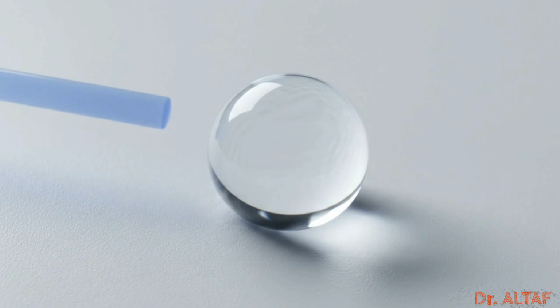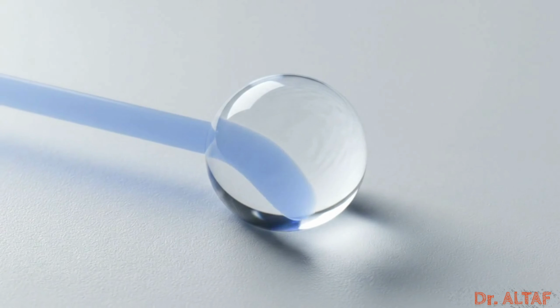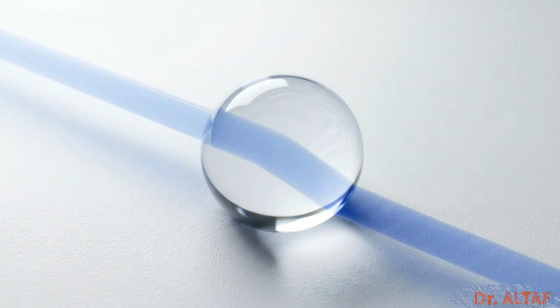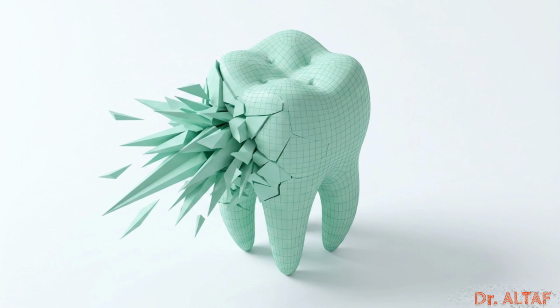Observe this magnified droplet. Intraoral scanners require an exceptionally dry field. Optical sensors are often far more sensitive to moisture than standard impression materials. When light hits saliva or blood, it physically bends. This refraction alters the angle at which the light returns to the scanner lens. That scattered light corrupts the optical signal. The software interprets the refracted light as a physical geometry, injecting chaotic spiky artifacts directly into the STL mesh.